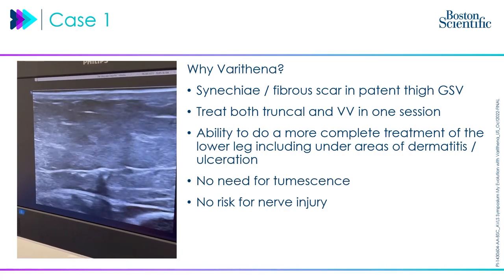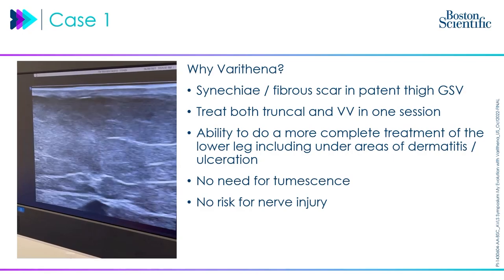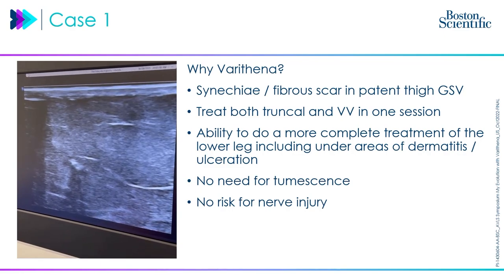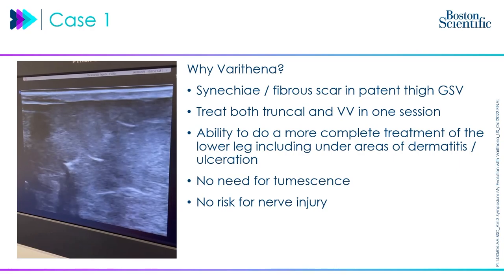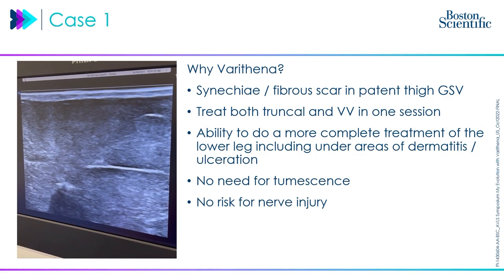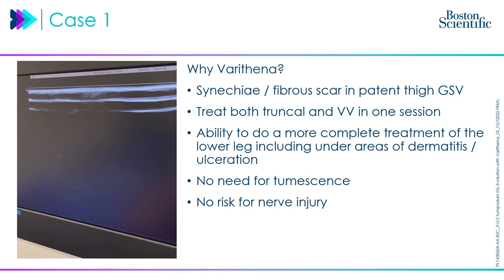But it is important, I think, and Dr. Darby made a good point, to have a second person who can help you with compression. Obviously, in this case it wasn't as necessary to hold the proximal GSV, but sometimes to hold some perforators. You may see most of them, but sometimes you see some of the foam trying to go deeper through a point where you were not suspecting. If you're going slow, you can easily catch that before you've delivered a ton of medication down to the deep system, and someone can help you hold that.